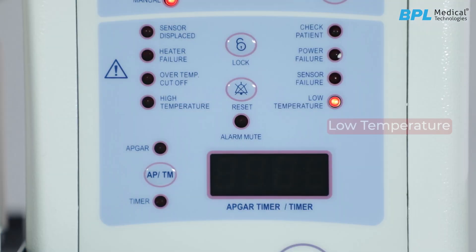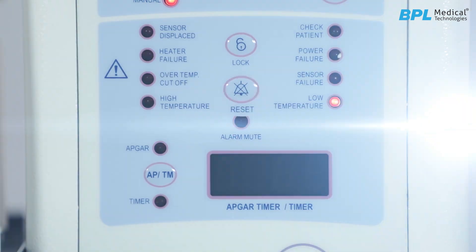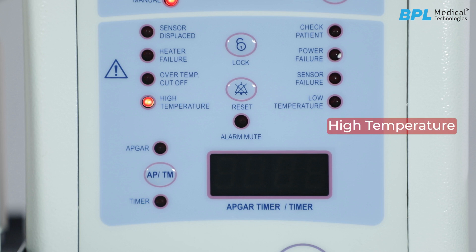Low temperature alarm: this will activate when the baby's temperature is one degree lower than the set temperature. The reset button is used to reset the alarms. High temperature alarm: this activates when the baby's temperature exceeds the set temperature by more than one degree.